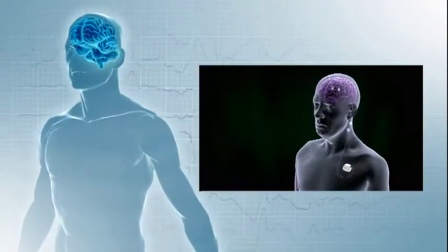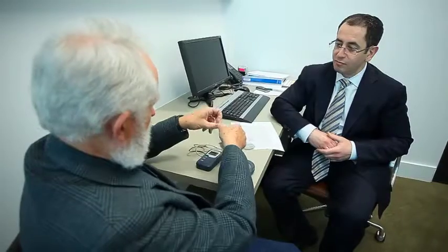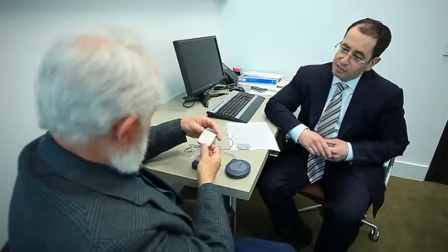We then plug those extension leads into an implantable pulse generator, or a battery. There are generally two types of batteries that we use: rechargeable batteries and non-rechargeable batteries.